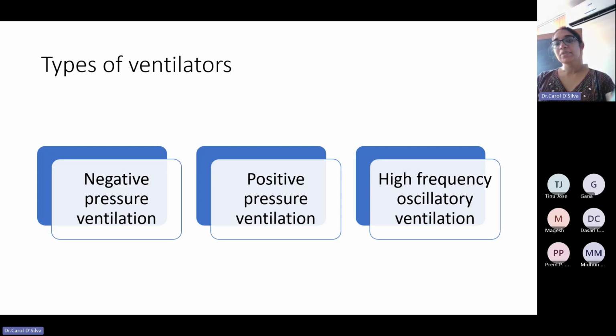Okay, so there are 3 types of ventilators actually. What are these? Positive pressure ventilation. What does positive mean? We are all negative pressure ventilators, yes? Our intrapleural pressure is negative, we make it more negative, and that's how gas moves in. Have you heard of any machines that can generate an intrapleural pressure, making it more negative? Yes, beautiful. This is the iron lung.